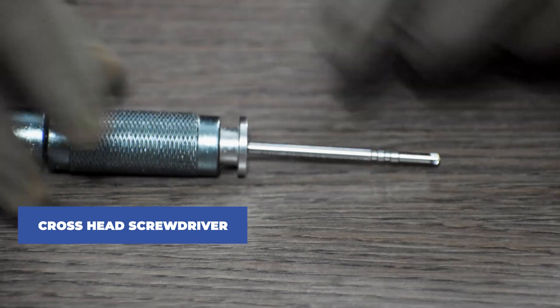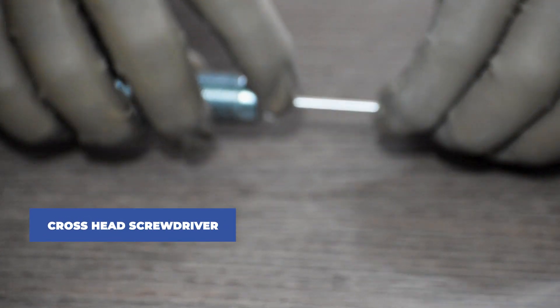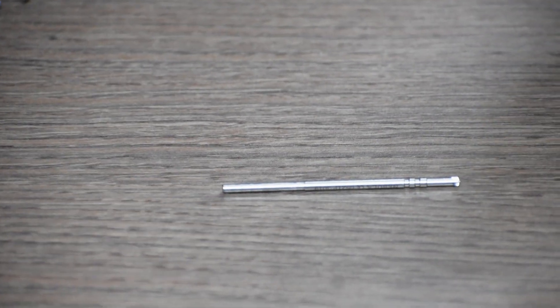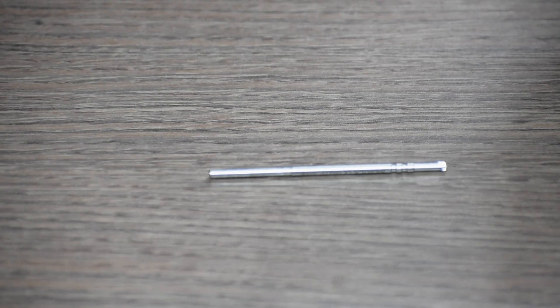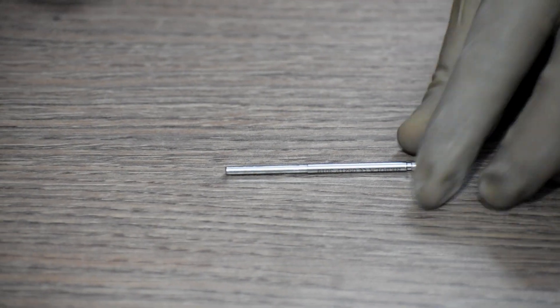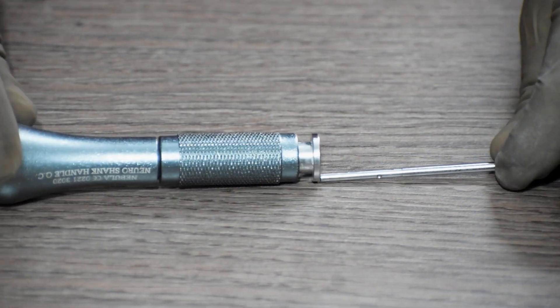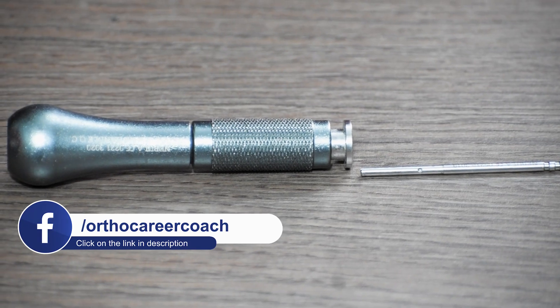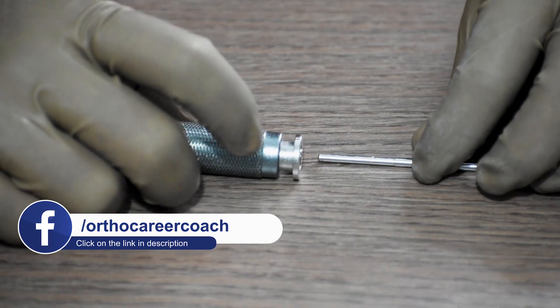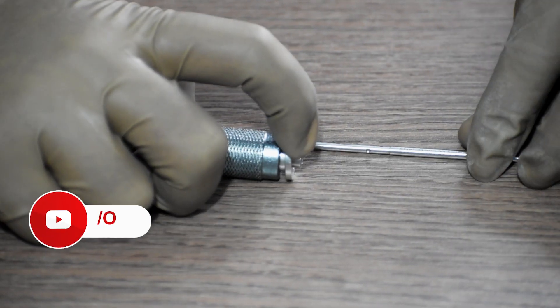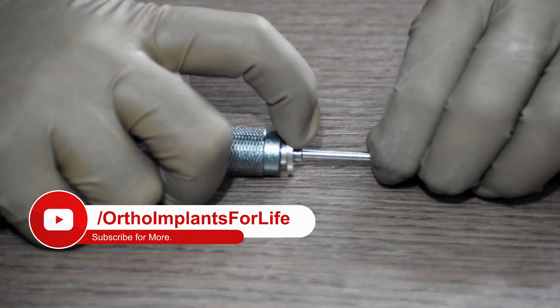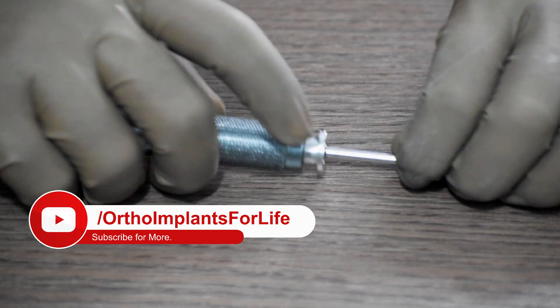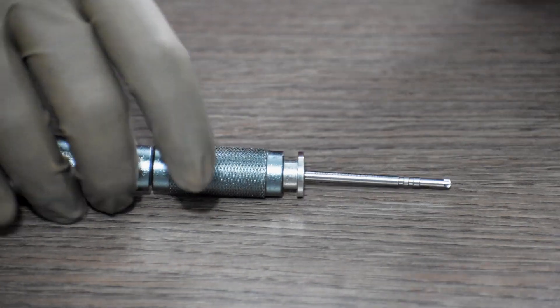Next, we will require a cross-headed screwdriver. The handle of the screwdriver is detachable. You can attach the screwdriver head in the handle by pushing this ring backwards and inserting the screwdriver head in the handle. Once you release this, it will get locked and you can use the screwdriver as intended.